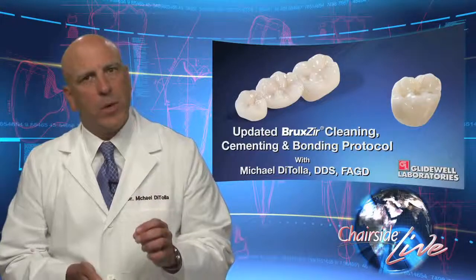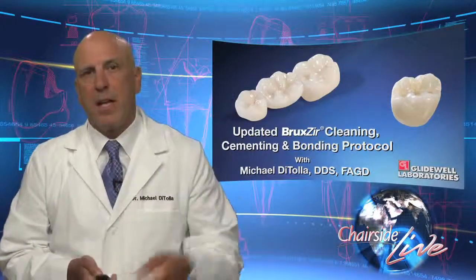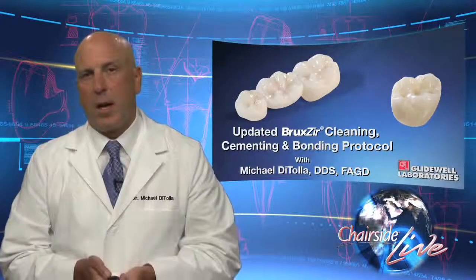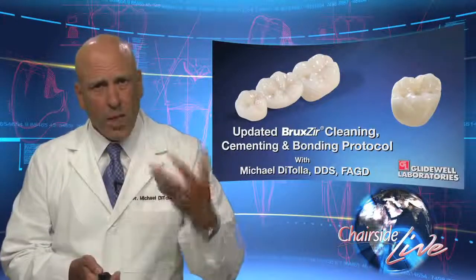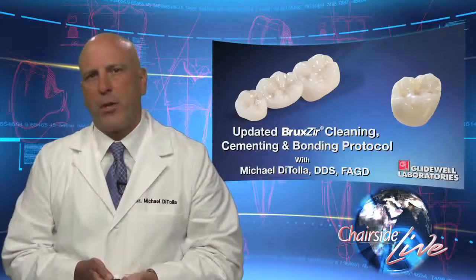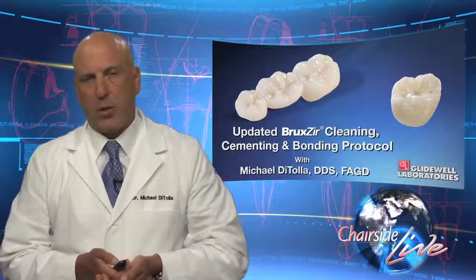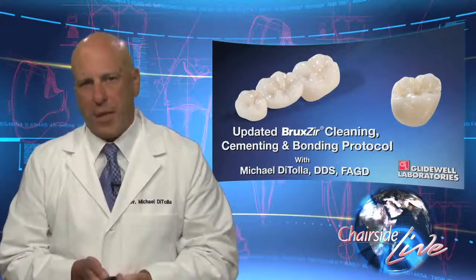In fact, the one time you definitely want to use hydrofluoric acid on Emax is if you've tried it in with some sort of silicone. If you used something like Fit Checker, where you mix up a silicone, put it on the inside of the crown, and try it on the tooth to verify the fit, that's going to be a time where you'd rather use the hydrofluoric acid rather than the phosphoric acid when cleaning out the crown and getting ready to cement it. So that's really the one thing about Emax.